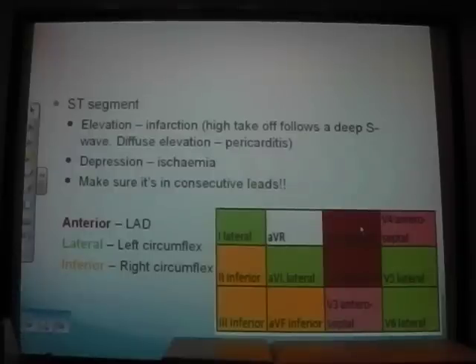To distinguish, check for a deep S wave and whether it's concordant across your territories, so it happens in each of those leads. Depression means ischemia, and it's always good to know which artery is represented by which territory.